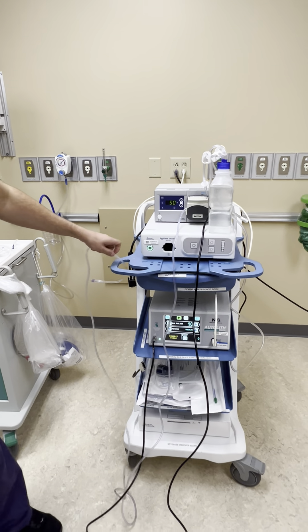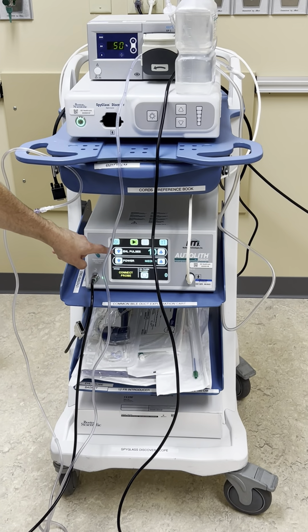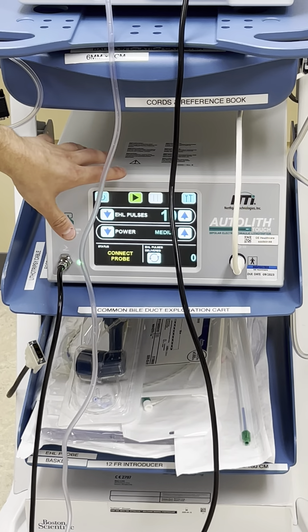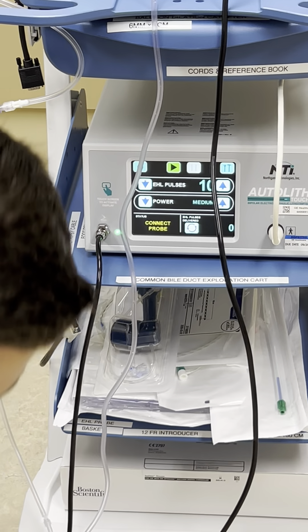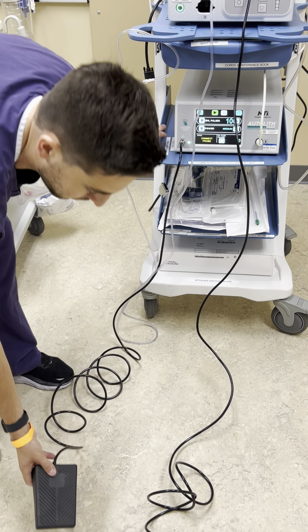The next thing you're going to do is use your EHL lithotripsy unit. You can adjust the power and the pulses on here. There's also a play and pause button so it's either on standby or ready to shoot, and you will use this foot pedal for the EHL — that will be connected and stay with the cart as well.